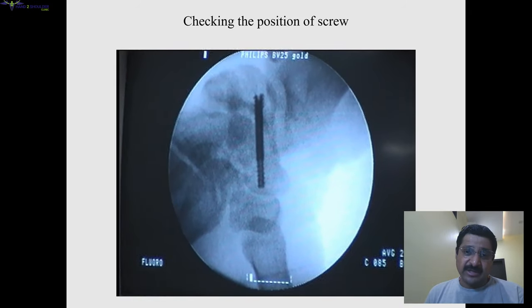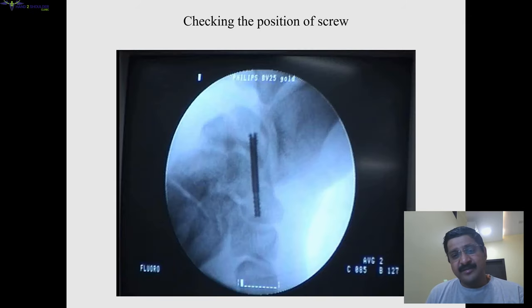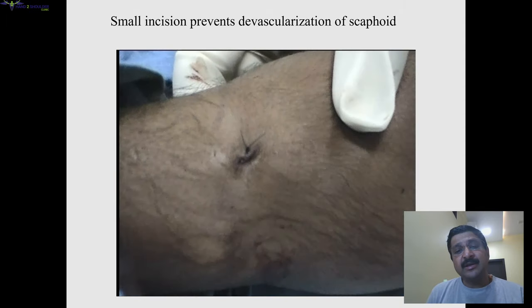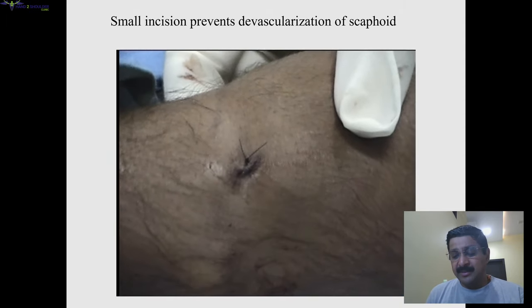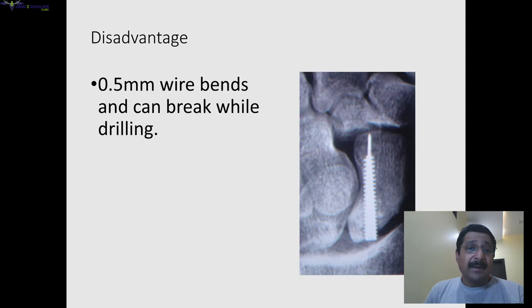Once you have done it, remove your guide wire, again check position in all directions, and once satisfied you can close the wound — a single stitch is good enough, either non-absorbable or absorbable, it doesn't matter.